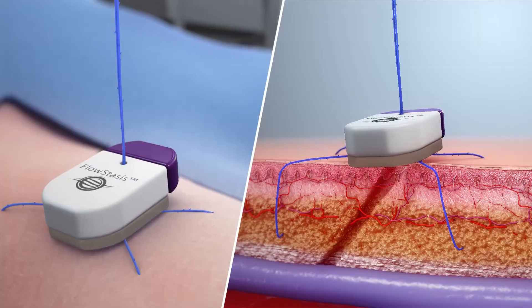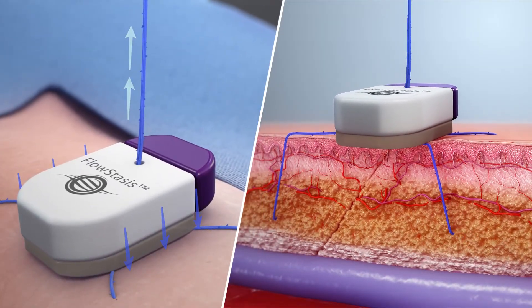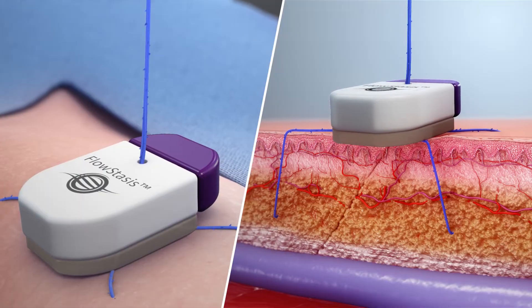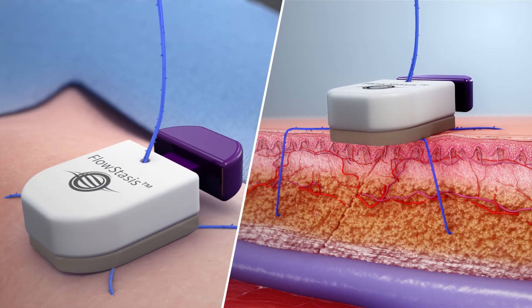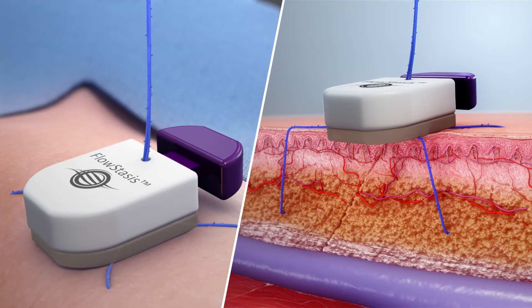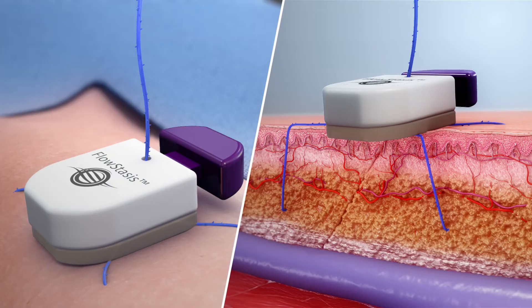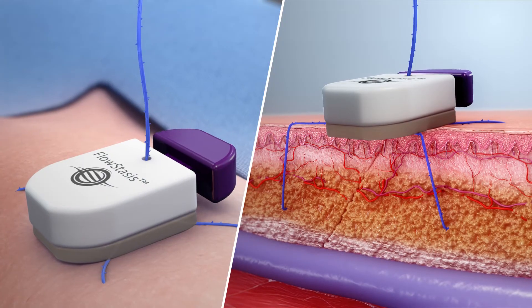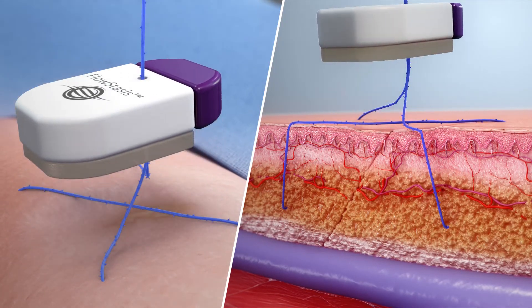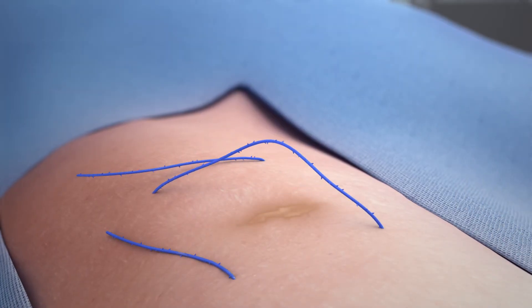Once placed, significant tension should be applied. The purple tab is released to secure the sutures. The tab can be engaged and disengaged to adjust suture tension during and post-procedure. For removal, the tab is actuated and the device is simply pulled off the sutures. The sutures can then be removed.